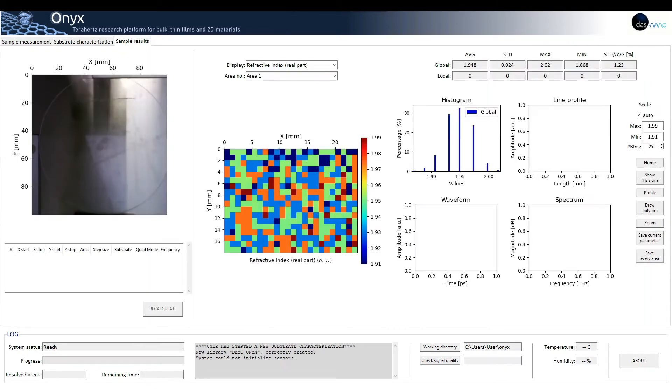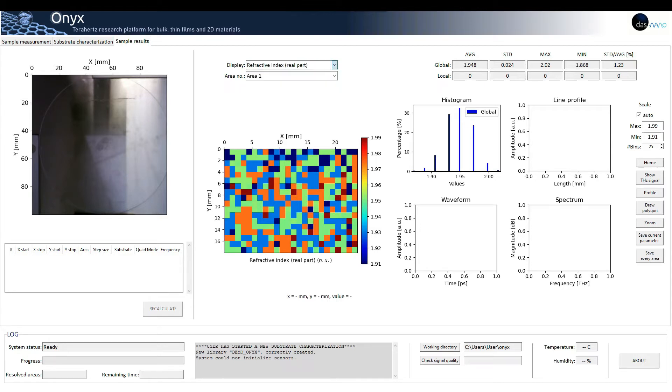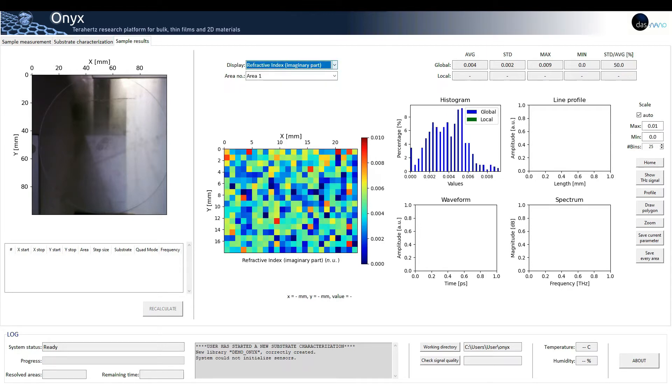In addition to this, the third tab, sample results, will also appear, so the user can analyze the substrate refractive index and the dielectric constant more in detail.